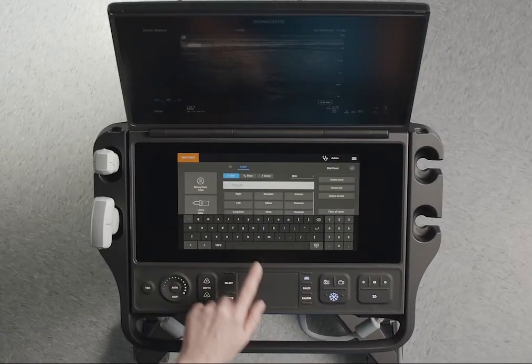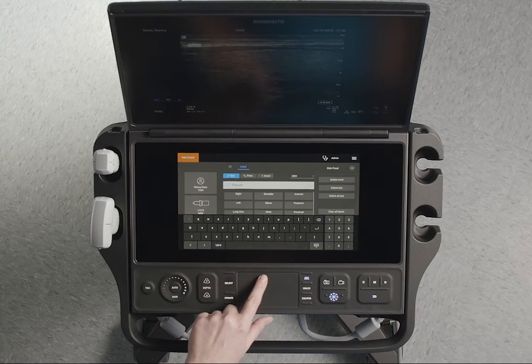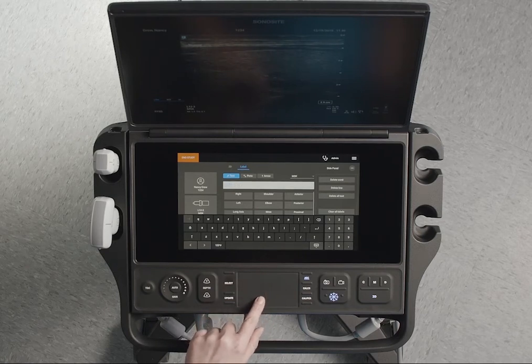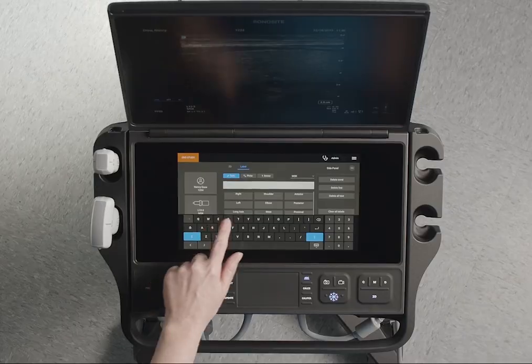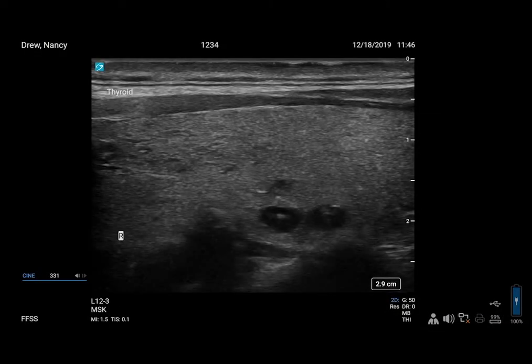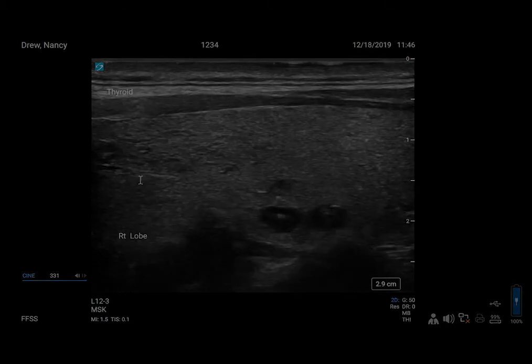Now let's enter another label. You'll need to move the cursor to another location on the monitor using the touchpad. Tap the keyboard in the text box and type in another label. You can edit, move, and delete any of your labels.